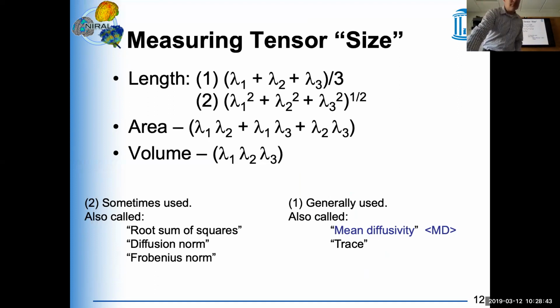Is there any benefit versus the others? Obviously there wasn't enough, because it went on later. Yes, well, there's a benefit when you're looking at multiple measures. Some of these measures that we extract of size and shape are orthogonal to each other from a mathematical perspective, and some of them are not. Theoretically, it would be good if they're orthogonal so that when you analyze them, they're not highly correlated.